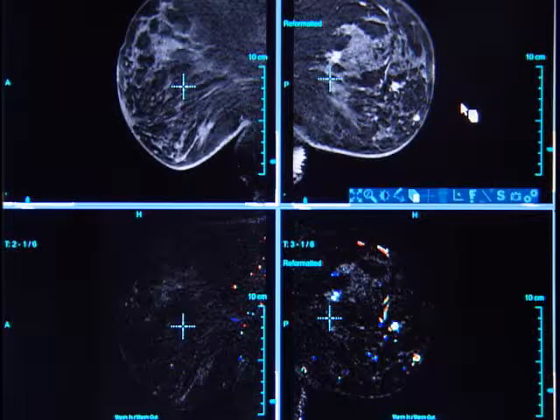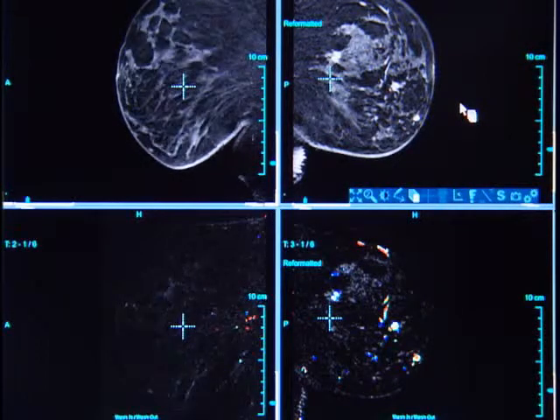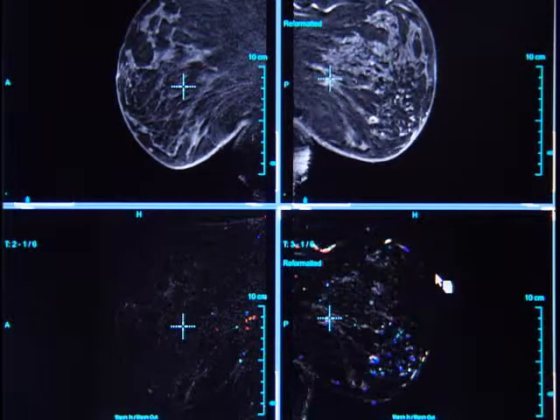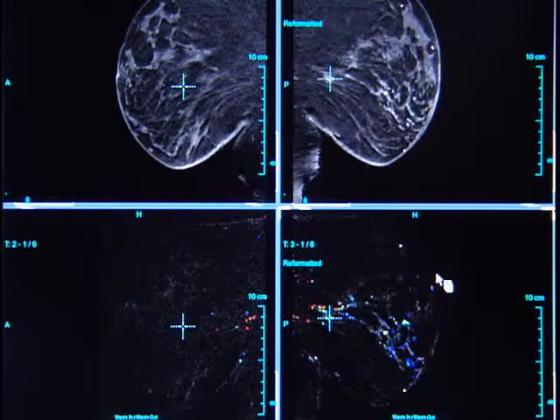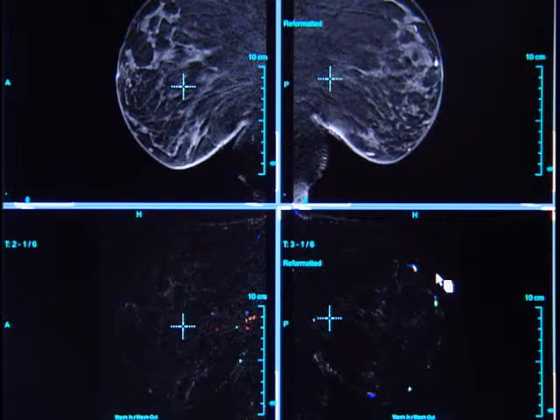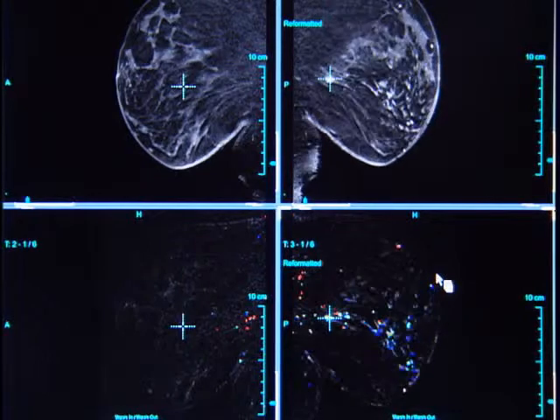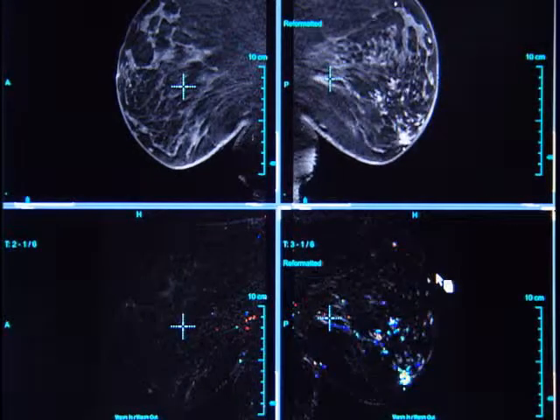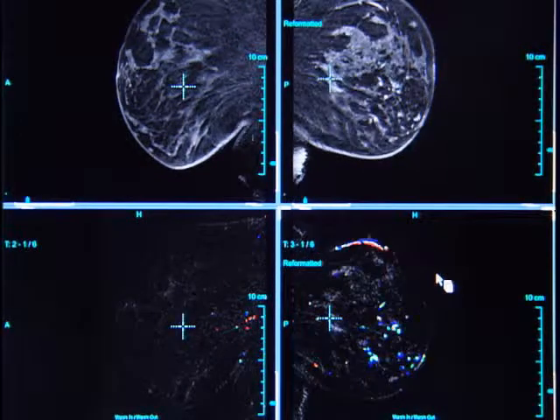Our last pull-down menu adds to the previous screen color parametric mapping on our one-minute subtraction images. Again, as you scroll through this case, you see this multifocal tumor within the left breast, with multiple areas demonstrating high-threshold degrees of enhancement and washout kinetics.